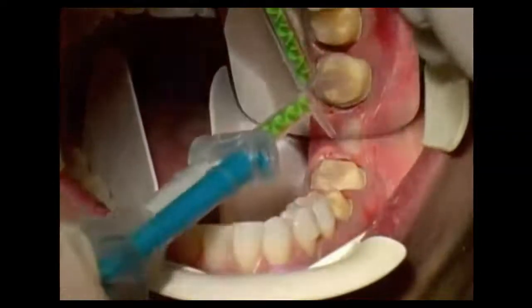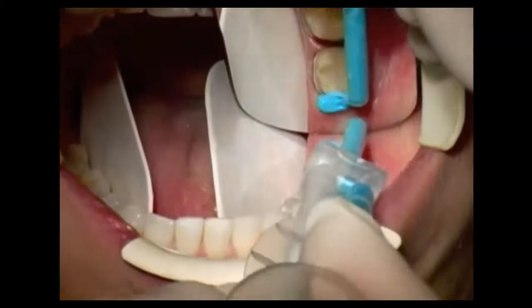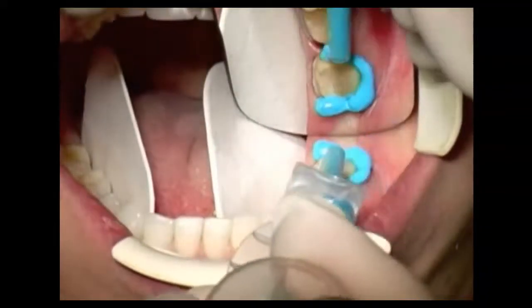The retraction cord has been removed, and the dentist is now placing the material, the light-bodied material, for the final impression.